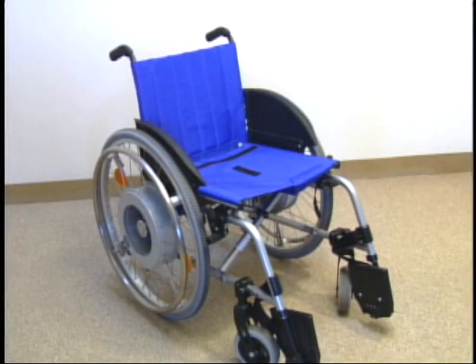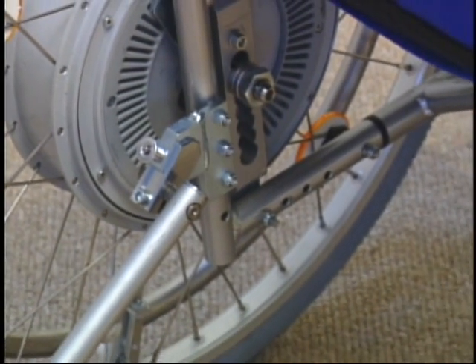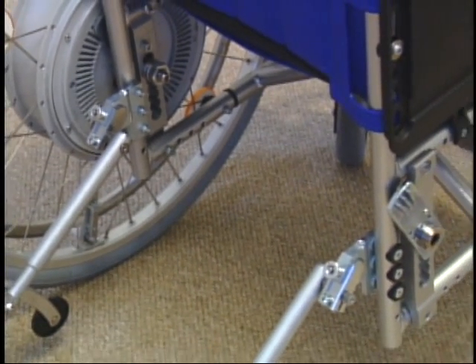Emotion consists of two direct-drive power assist wheels and a set of mounting brackets. No wires or cables are necessary to add the Emotion to a folding or rigid manual wheelchair.